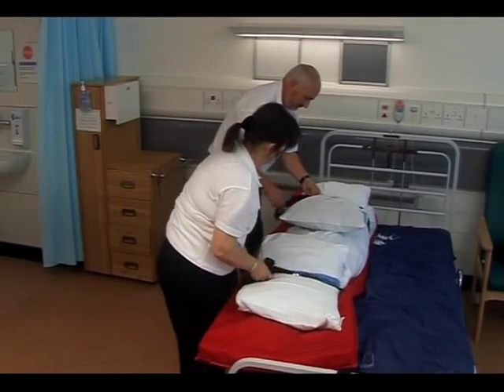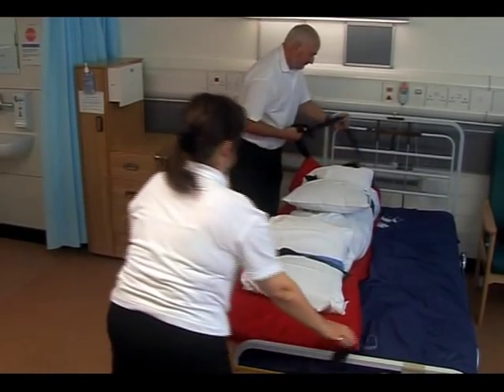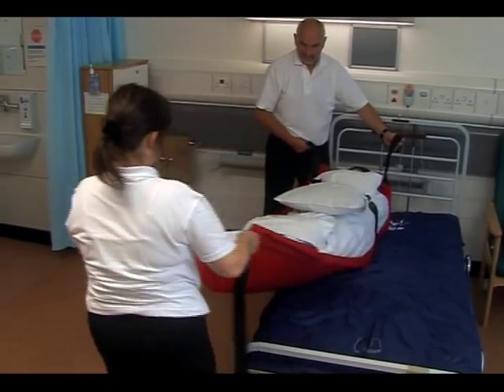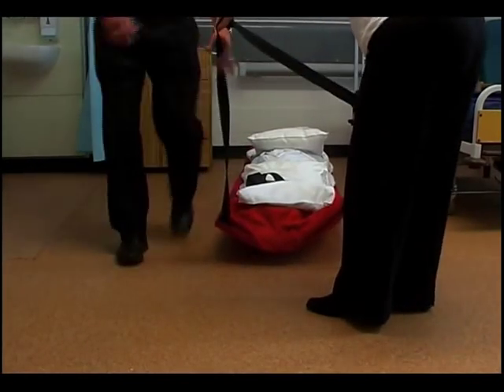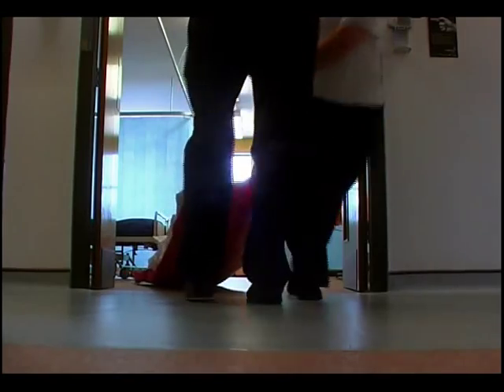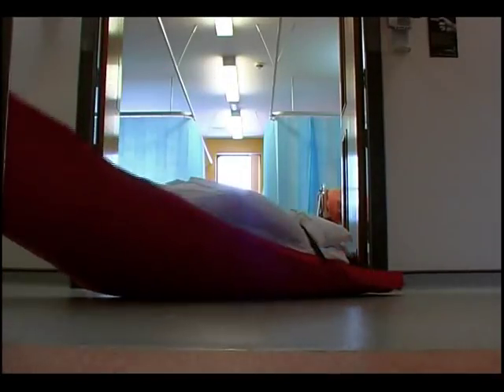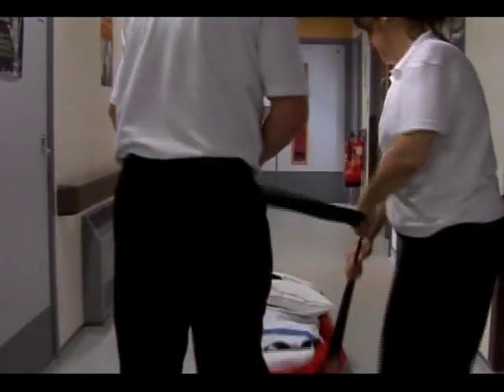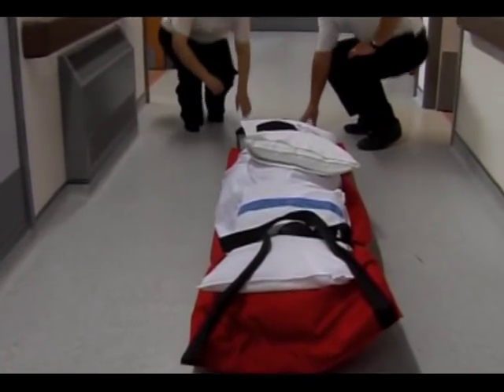Ensure that any loose ends are tucked under the cross straps to avoid trip hazards once the ski pad has been lowered to the ground. Taking the foot end first, gradually lower the ski pad to the floor, ensuring that the head is protected by the person at the top end. Once the ski pad is on the ground, it should be pulled from the same end by both carers, and if additional doors need to be negotiated, it is usual to pull through these head first to ensure that the doors will not shut on the head of the patient or resident. However, you need to remember that you must arrive at the top of the staircase feet first.